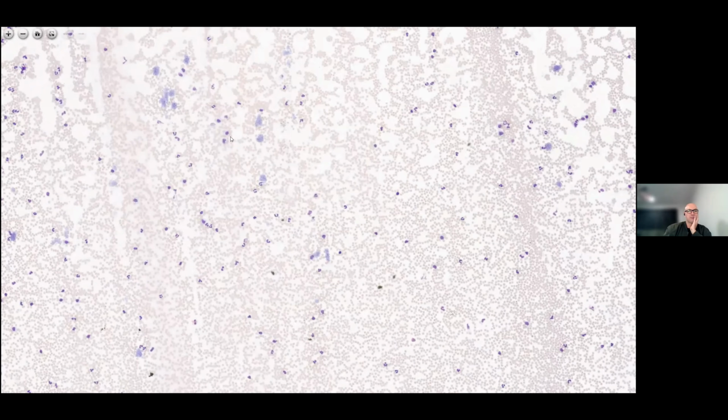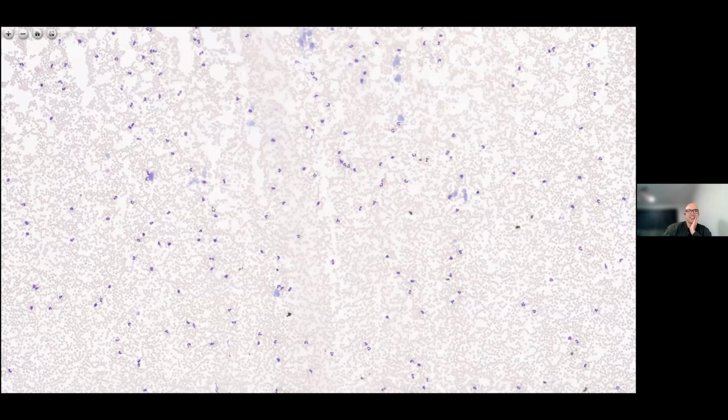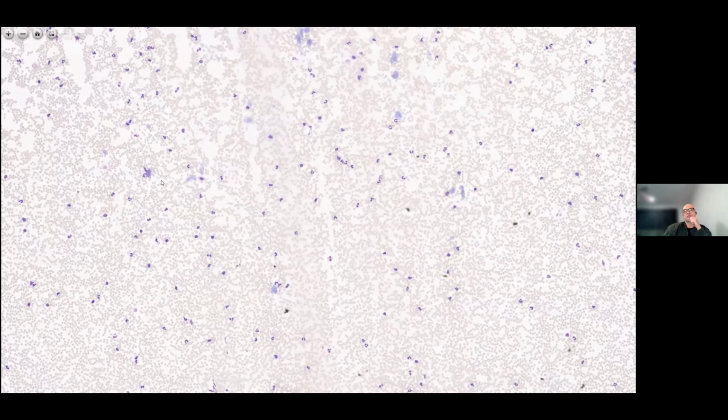As I mentioned in case one, you've got to remember not to get swept up in just thinking about the platelets in this case because there's so much clumping. We need to assess the film, because we've got a blood film here and we're probably going to be reporting results. There can sometimes be insidious morphology lurking in a case, and we don't want to get too relaxed just because we're reviewing the blood film because the platelet count's low.